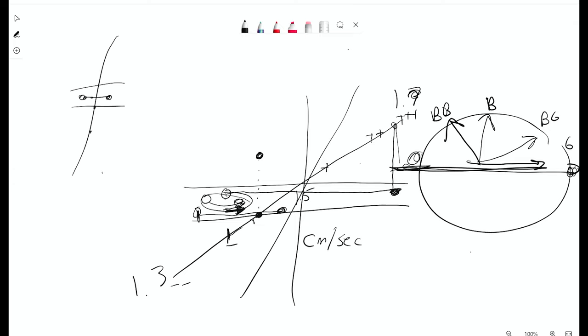But ideally for your CSF flow studies, if you're doing phase contrast, you want to be between probably 5 and 8 centimeters per second. Because any higher than that, you get wrap. So exactly. In our clock face, if I've chosen a 180 degree Venc, a 7 centimeters per second Venc, and really inside this vessel I'm going 8 centimeters per second, the computer gets confused and it flips. If this would be 4, this would be 5, this would be 6, this would be 7, this would be 8. So it gives it a black voxel when it should have given it a white voxel, and vice versa. So you'll see an image of your aorta, and everything is completely black. And then typically during systole, when it's pumping, you'll have a voxel that is just white instead. And that's aliasing.